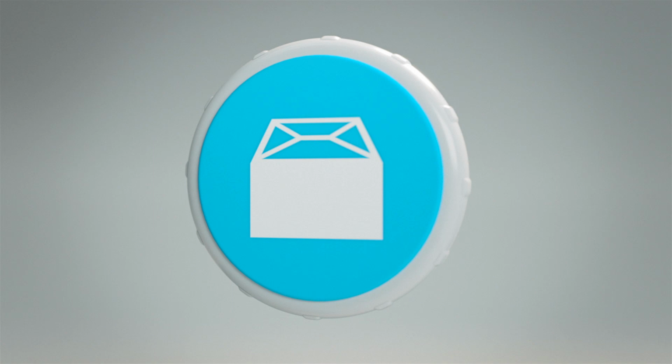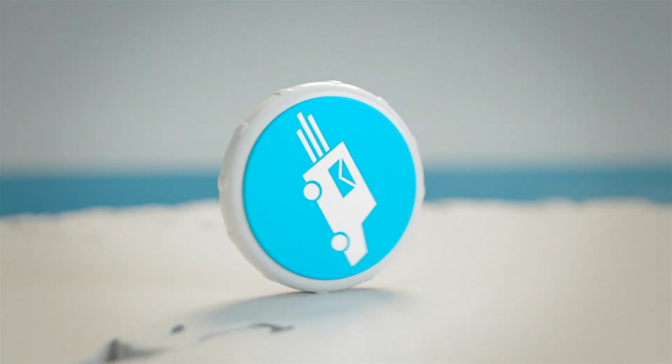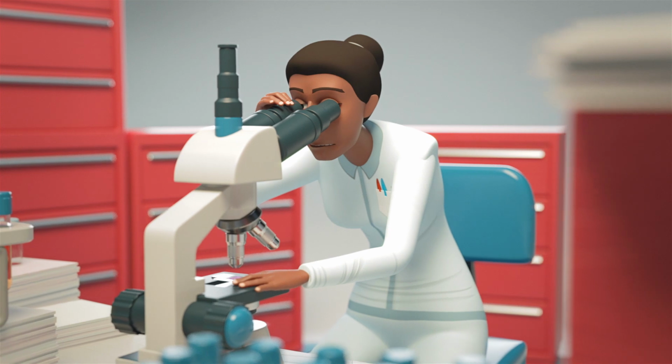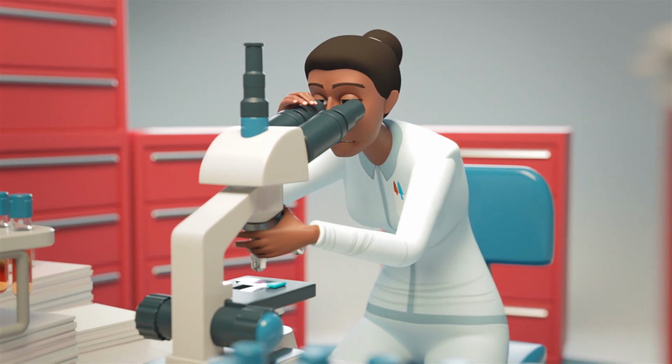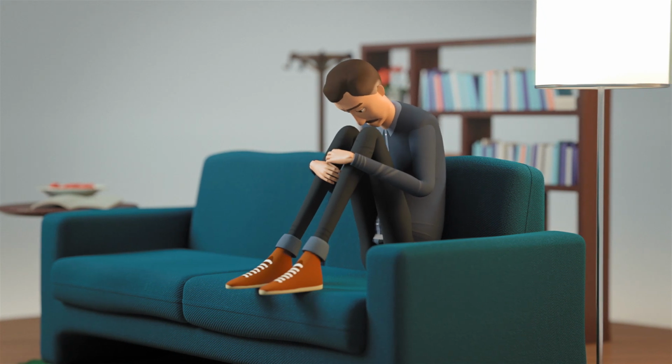The microscopy sample would have had to be packaged, labeled, and mailed to another part of the country. Once there, the package would have to be unwrapped, registered, and distributed to the right pathologist. This process would take days, even weeks, and the wait would have made Steinar concerned.